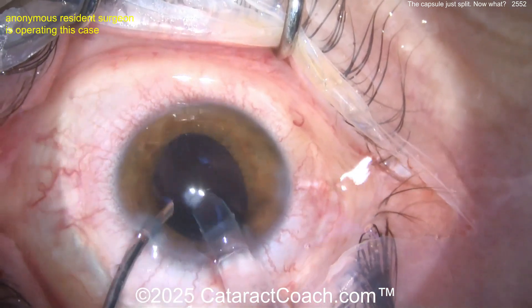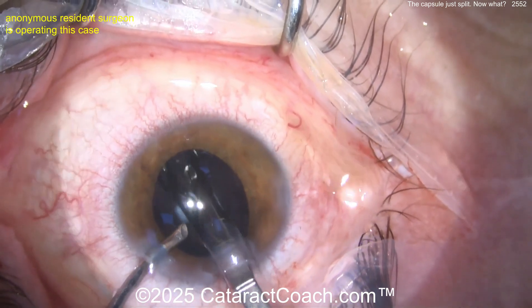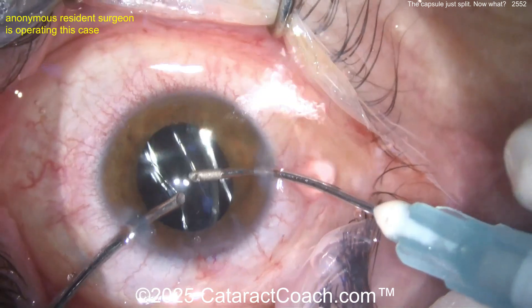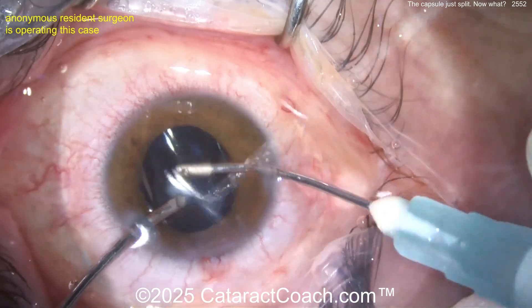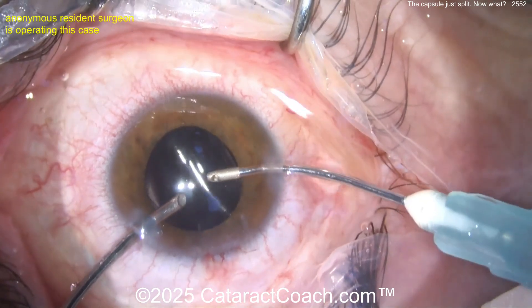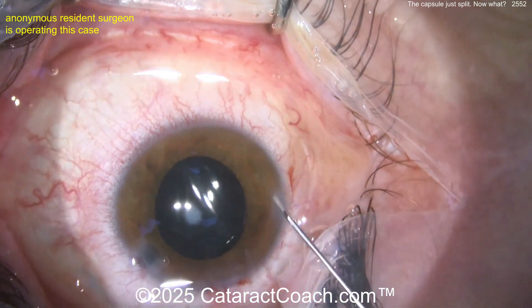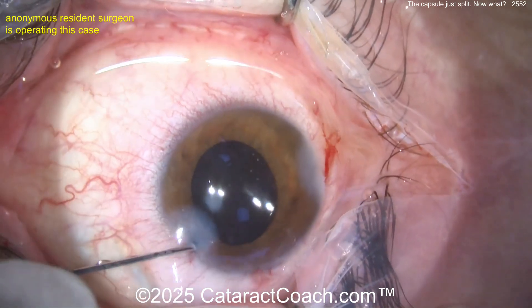Now let's get the lens in — hydroimplantation. Okay, reasonable. Here comes the lens — looks like a single piece going in the bag. That looks good. Now get the haptics opened up. You know what, maybe leave it be — you can always do a YAG capsulotomy later. Okay, don't mess with the posterior capsule. Now sealing up the incision. Alright, you got out of it.